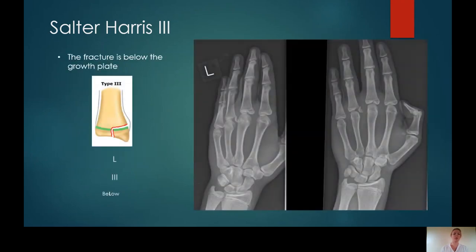Salter-Harris type 3 — the fracture is below the growth plate. Here you can see on the third and fourth proximal phalangeal epiphysis, the fracture runs from the articular surface up to the physis and then along the physis, not involving the metaphysis at all. So these are Salter-Harris type 3 fractures.